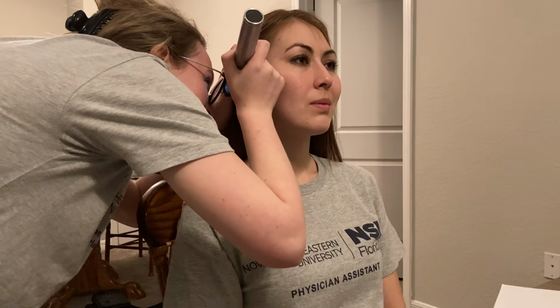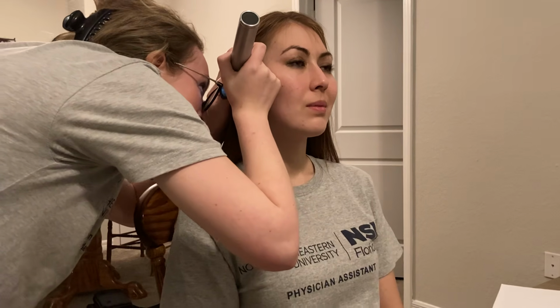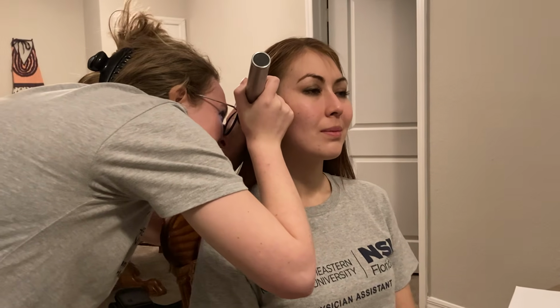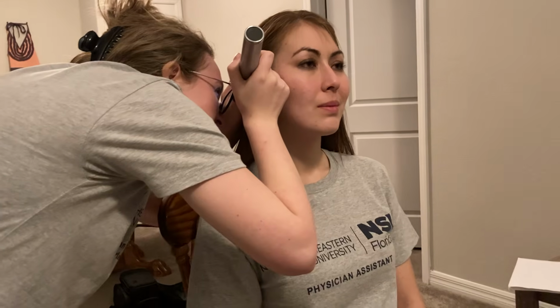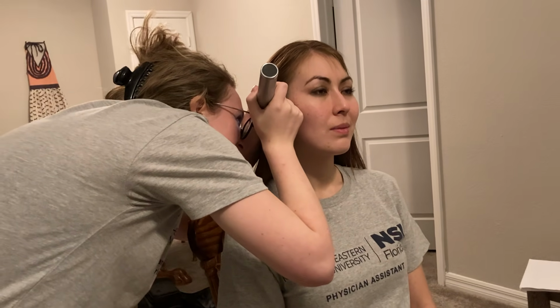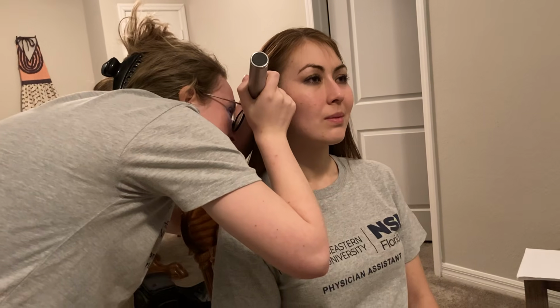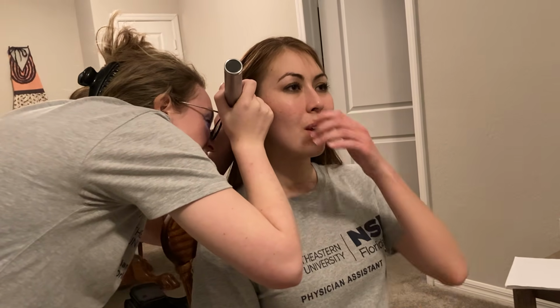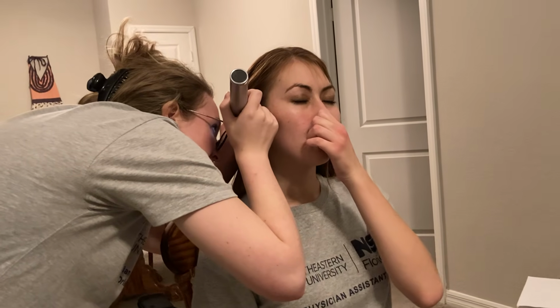And I also see the malleus, I see the umbo, and pars flaccida and pars tensa as well. And then additionally, I see that in the middle ear, there's no fluid. So would you mind plugging your nose and popping your ears for me? Beautiful, that tympanic membrane is mobile.